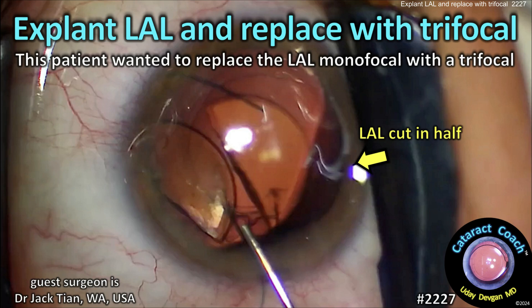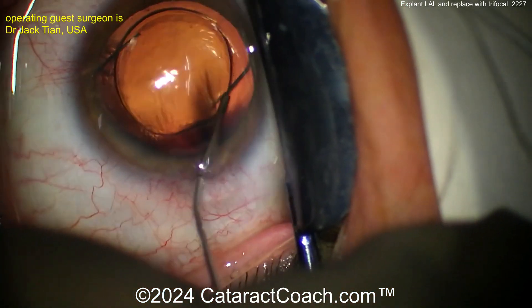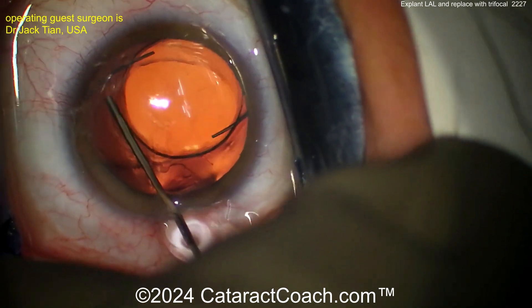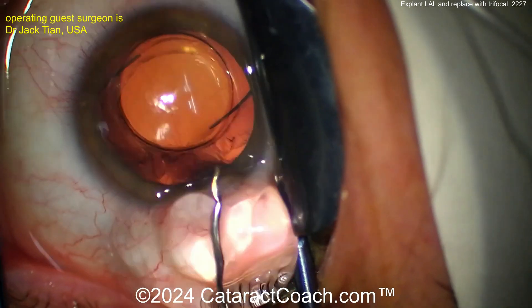From cataractcoach.com: we're going to explant the light adjustable lens and replace it with a trifocal. This patient was not happy with the outcome of the light adjustable lens. One of our challenges in any patient is setting appropriate expectations and making sure that the technology we give the patient is going to meet those expectations. Here we have a patient who got this monofocal lens and just for whatever reason is not happy.